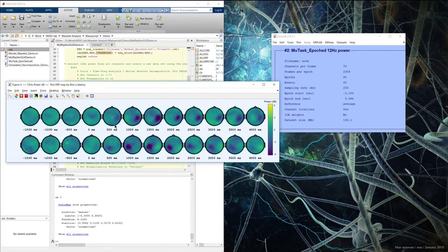By running this, electrode C4 is convolved at every frequency and the power output at each frequency is added as a new data channel. Now we have this new 'C4 Freqs power' dataset. Opening the data scroll, rather than electrodes we have wavelet center frequencies, with traces showing the power at each of those frequencies. Now we'll compute the averaged ERD using ERPLAB and name the ERP set 'C4 ERD.' Then I'll baseline normalize it to decibels from negative 1500 to negative 500 milliseconds, giving us the new 'C4 ERD dB' ERP set.